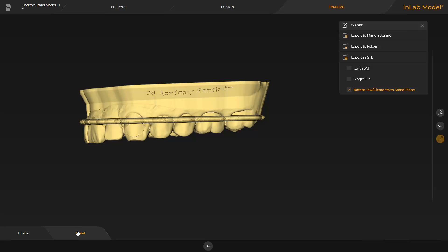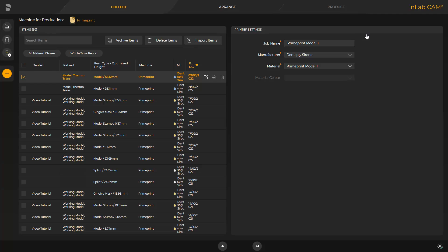Alternatively, the model data can be saved to a storage medium or in STL format. After the InLab CAM software is opened, all cases previously transmitted are displayed. The thermoforming model that was exported earlier is already selected. Here, we can either select the so-called Fast Track by tapping the double arrow, or we can switch to the next phase, the Arrange phase. Fast Track will take you directly to the last phase, Produce, where the InLab CAM software automatically positions and orients the print object on the building platform and also defines the support structure automatically.